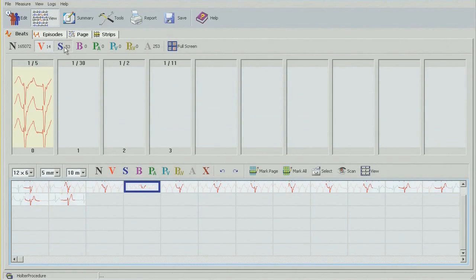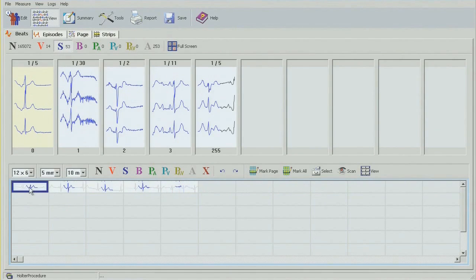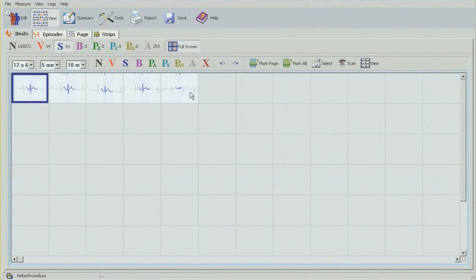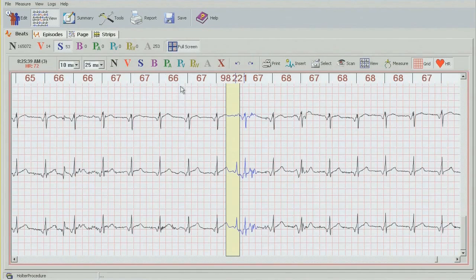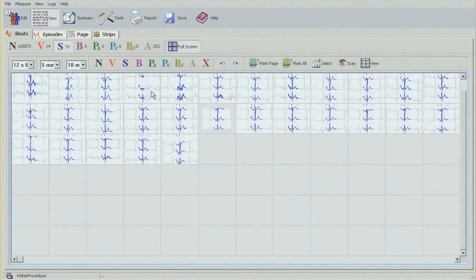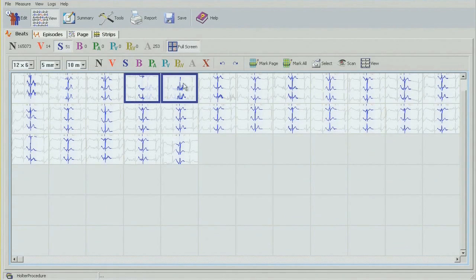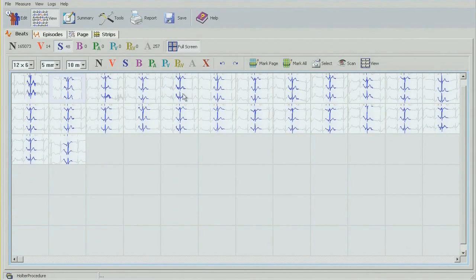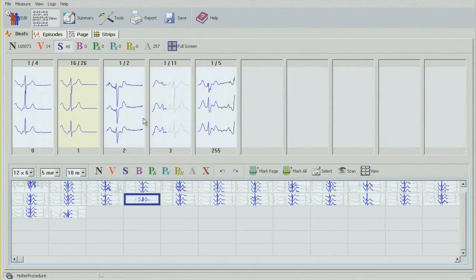Moving on to supraventricular beats and repeating the same action — Z button to open. There's only one beat that's an artifact, so I'll double-check by double-clicking, which takes me to the full disclosure page mode. Obviously there's nothing there, so I can either artifact it or delete it using the X button, and go back with a double click. This takes me to the next bin — there are two beats here that don't belong, as well as this one. I'll change them into artifact, and use Z to go out and continue.